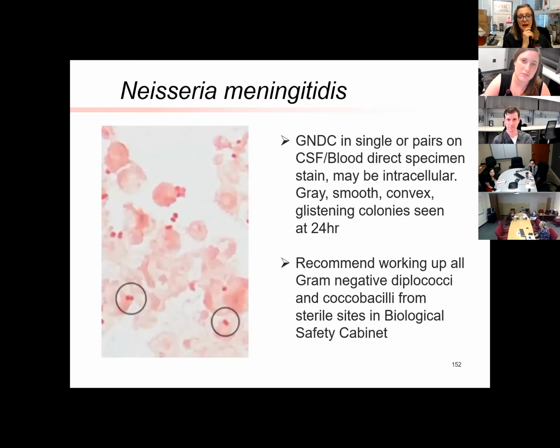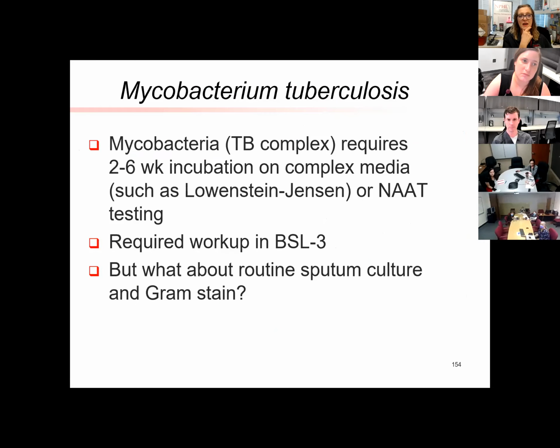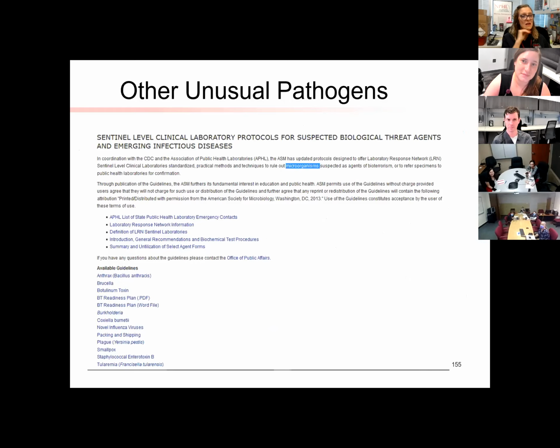I also talked about Neisseria meningitidis. I just want you to read through that on how to identify it. I talked about TB because we're beginning to get worried about TB because, well, it's an organism that not many labs do, but they're trying to do it in their BSL-2 laboratory. So it could be problematic, and I worry about laboratorians coming down with it.